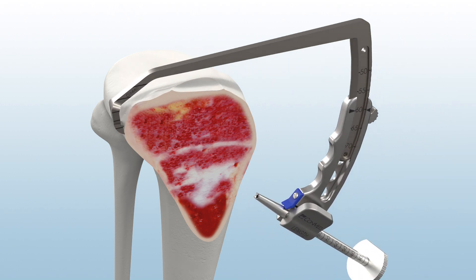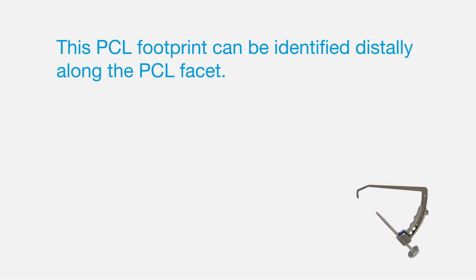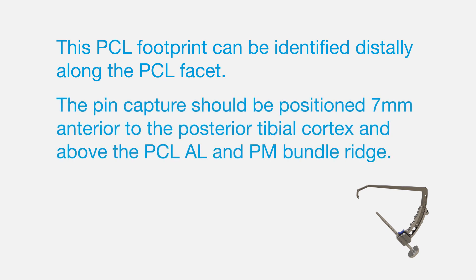Insert the guide arm through the anteromedial portal and place the pin capture of the guide arm over the tibial footprint. This PCL footprint can be identified distally along the PCL facet. The pin capture should be positioned 7 mm anterior to the posterior tibial cortex and above the PCL-AL and PM bundle ridge.